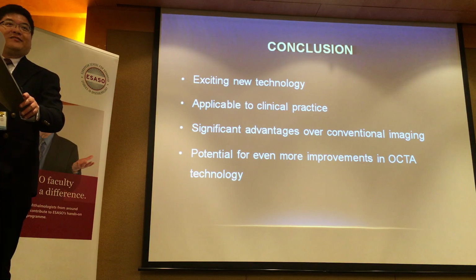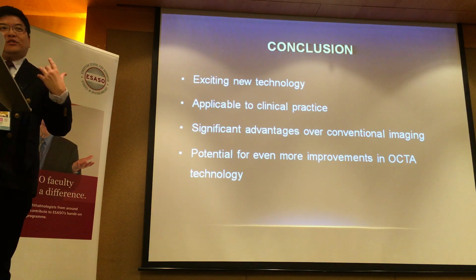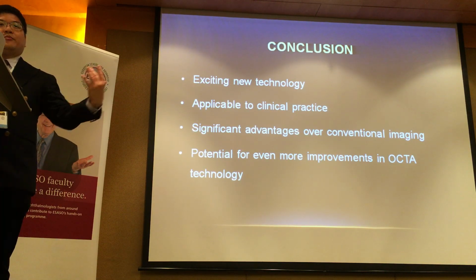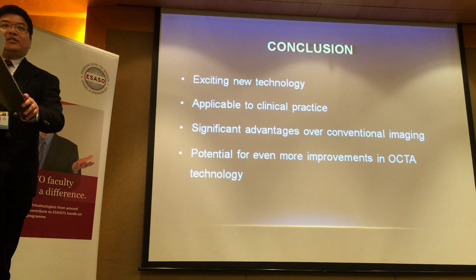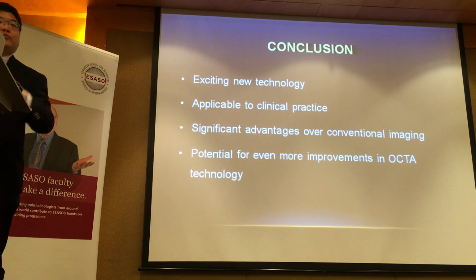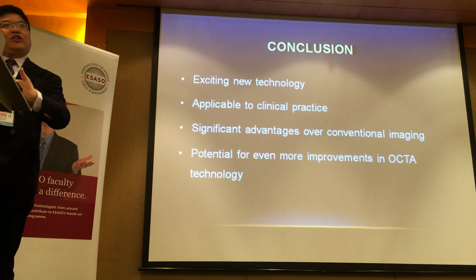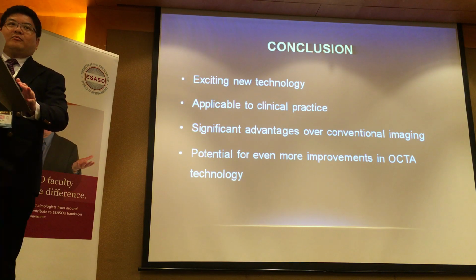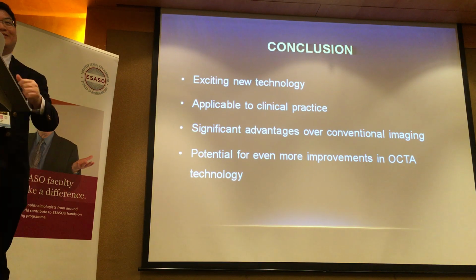I use the Heidelberg. If there's an indication for an OCT-A, then I will ask for it. Or if I had pre-planned this as a follow-up patient, I may have said do both at the same time. But I would not rely on the OCT-A, even on the same device like the Heidelberg or the Triton. All of these have, of course, the structural scan. But yes, you're absolutely right, the resolution is less. I would not want to base my treatment decision on that, but it's useful to correlate though.